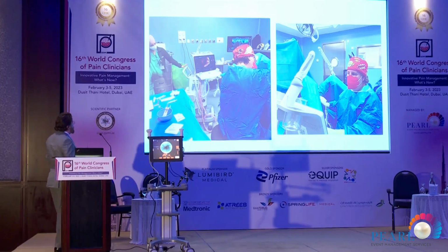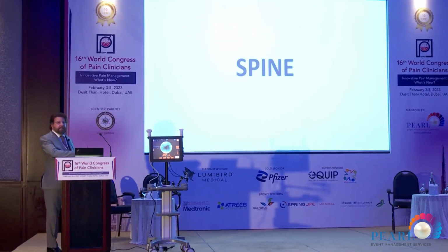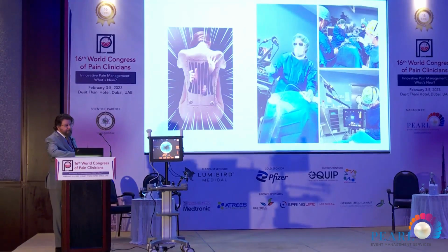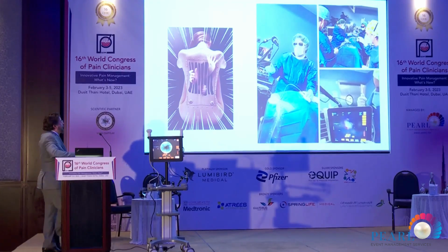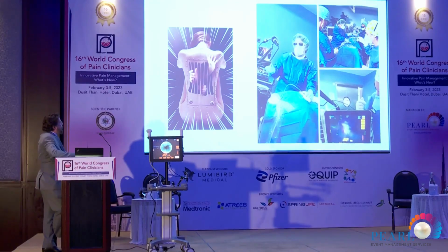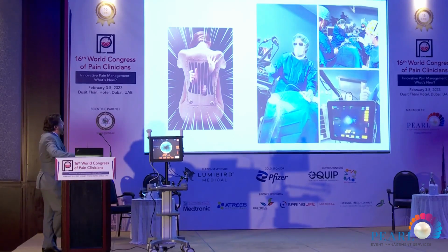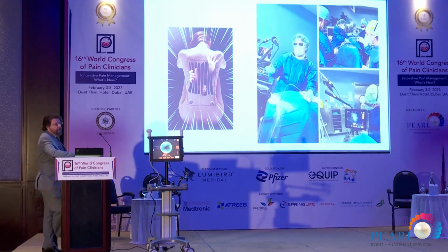Look at my surgery room, working by the transperineal way, and in the spine. Remember that this is a symposium. If you have any question in the symposium, it's no problem for me. For the spine, it's a big problem at this moment. Remember the patients who suffered arthrodesis or maybe fibrosis, scar in the spine, but I have the opportunity to control it with this technique. It is like epiduroscopy.